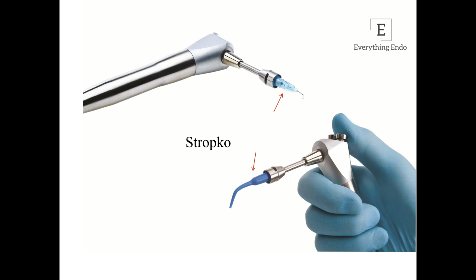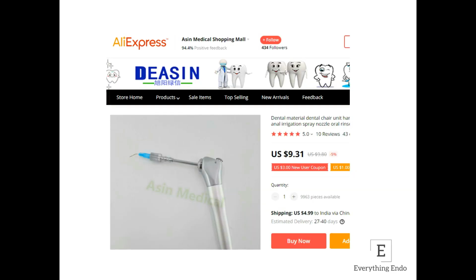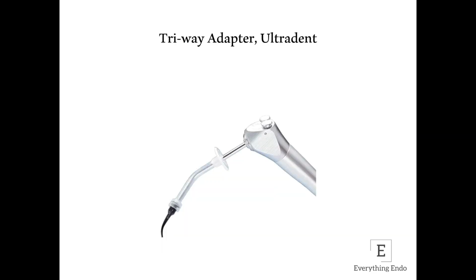So when debris accumulates on the floor of the pulp chamber, the Stropko is a very essential aid which is going to help you blow out this debris and keep the area clean. So these Stropkos we've discussed are a little pricey, and in case you do not want to invest that much in a Stropko, these are a couple of products that I've actually come across online. I'm not too sure if they are as effective as the original one, but better than having nothing at all. And this is the tri-way adapter from Ultradent, which I have not used but can help the purpose.